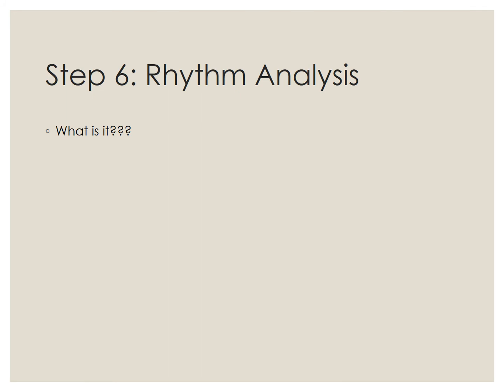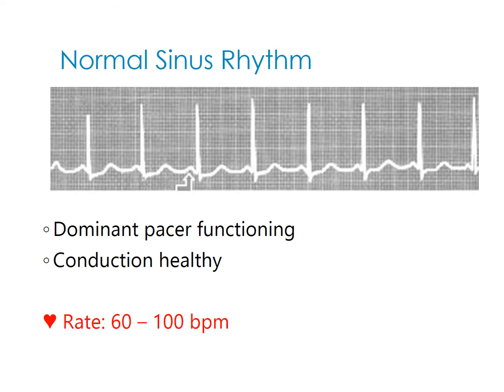So then rhythm analysis, what is it? We're going to figure that out soon, and we're going to practice in class with lots of strips. Okay, so that way you will feel more comfortable with this. Alrighty, so here's our different rhythm analysis.